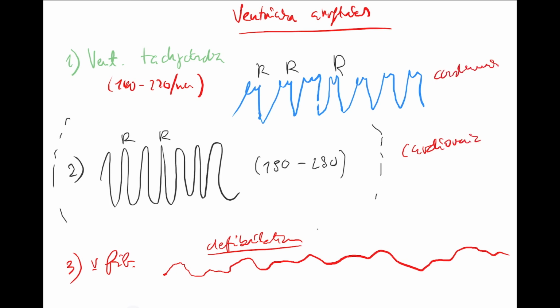Okay, but with the arrhythmias, remember V-tach, then even faster. Very debatable, we don't know. Ask cardiologists in the higher years if they still believe in flutters, ventricle flutters or not. Okay, and then definitely V-fib. Everyone believes in that. Okay.